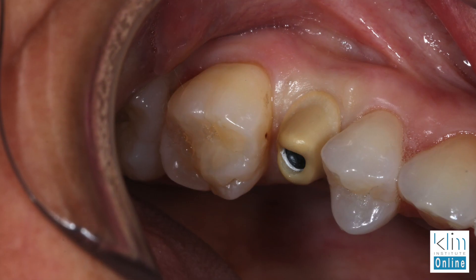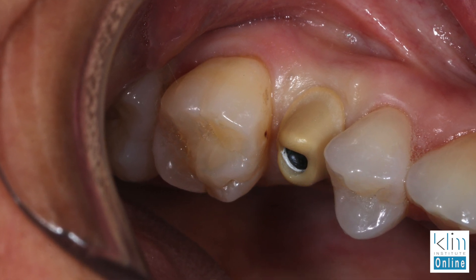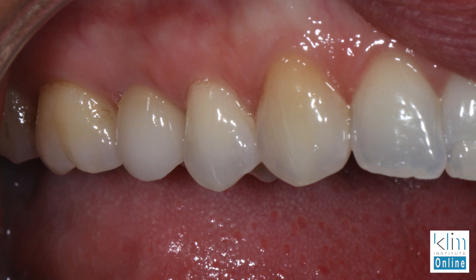Most of my cases involve taking the scan intraorally before I'm ready to load the implant. It could be in two situations: we're uncovering a buried implant, and I take my scan post-impression then, or I take the healing collar off and take my scan post-impression about a month before I load. When the patient comes back in a month for loading, all we do is screw this in — it's so accurate and I'm really pleased with the way it's going. This is the seated restoration and final abutment representing the case that was finished for this technique. It was streamlined.